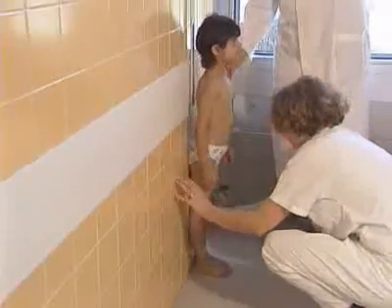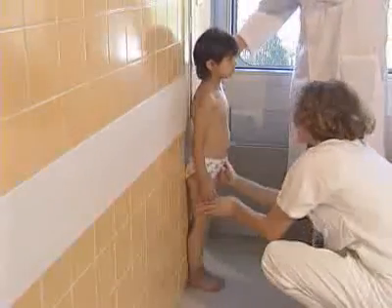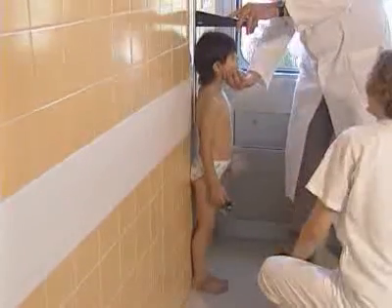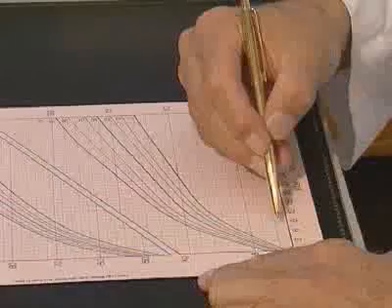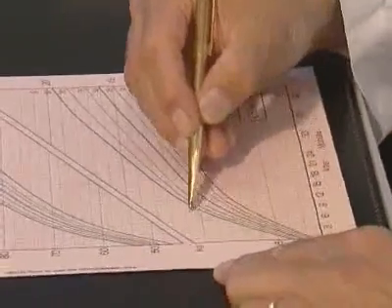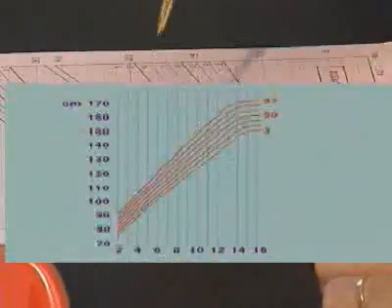Older children are measured in a standing position. The child should be standing upright with its heels, seat, shoulders, and occiput against the wall. The child's height is then determined using a sliding marker. Head circumference, weight, and length are entered onto a so-called percentile curve according to the child's age and sex.